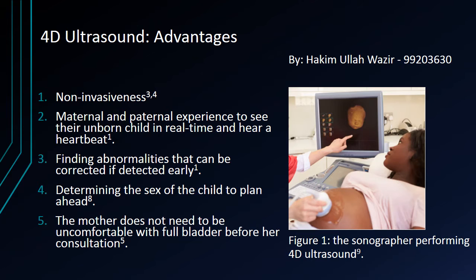Number 2. The technology is an upgraded version of the 3D scan. The extra dimension is time, and hence the fourth dimension allows for viewing moving images in real time. So in the case of a baby inside a mother's womb, you would be able to see a baby kick, open and close its eyes and mouth, and so forth.